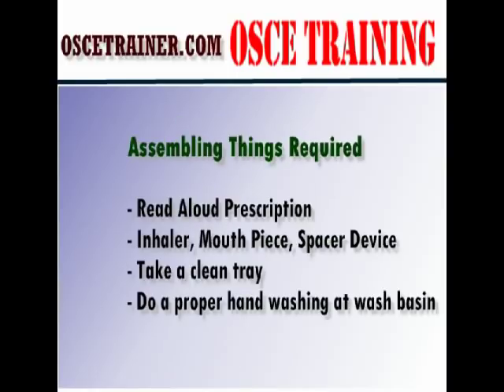Regarding the assembling of things, you need to read aloud the prescription, including the person, drug, dose, route, date, and time of administration. Ensure validity of the prescription, signature of the prescriber, and legibility of the prescription. If any of these pieces of information are missing, unclear, or illegible, then the nurse should not proceed with the administration and should consult the prescriber. Collect the inhaler with the mouthpiece, spacer device, and gloves in a clean tray. Do a proper hand wash using 7 steps of hand hygiene at the wash basin. After drying your hands, take the tray to the patient's side along with the prescription.